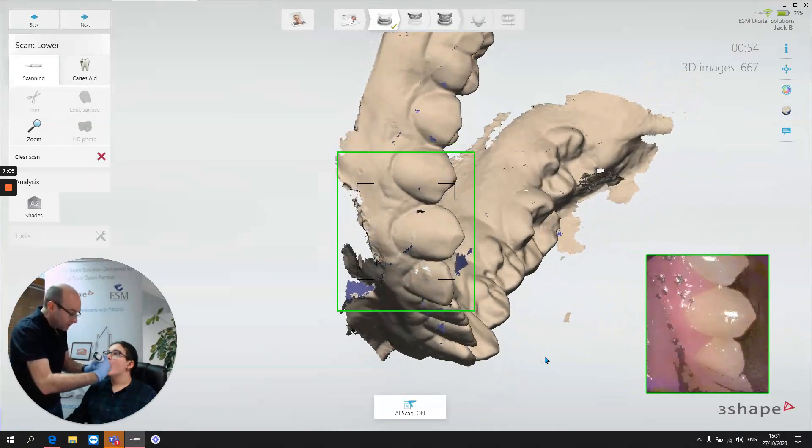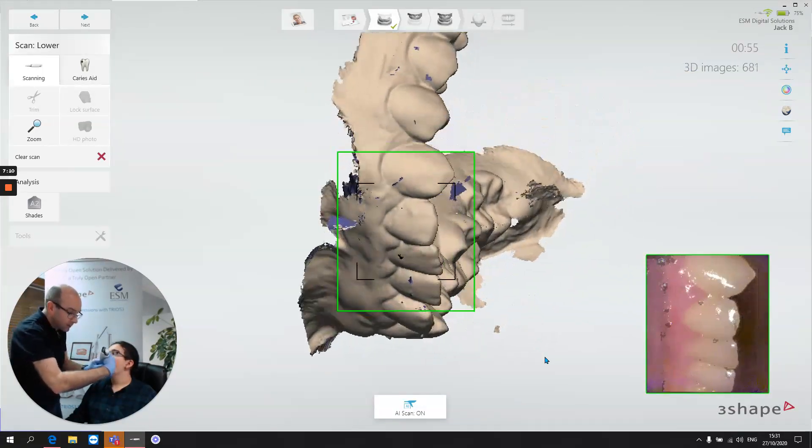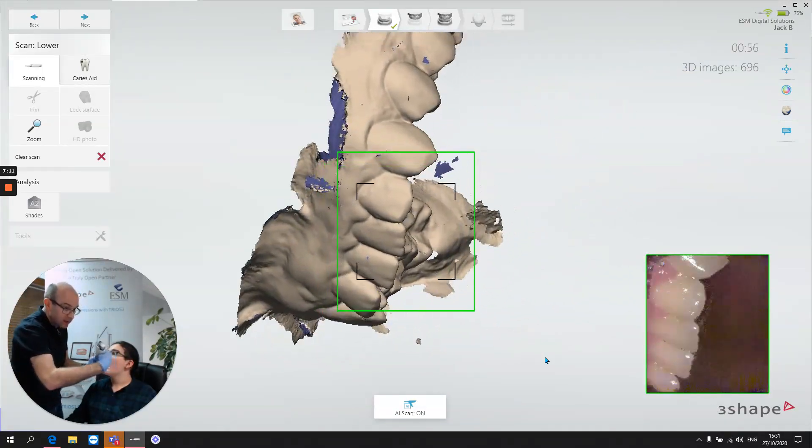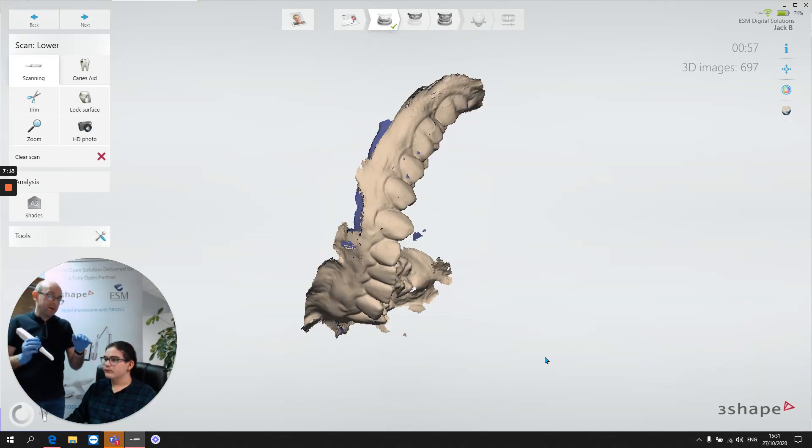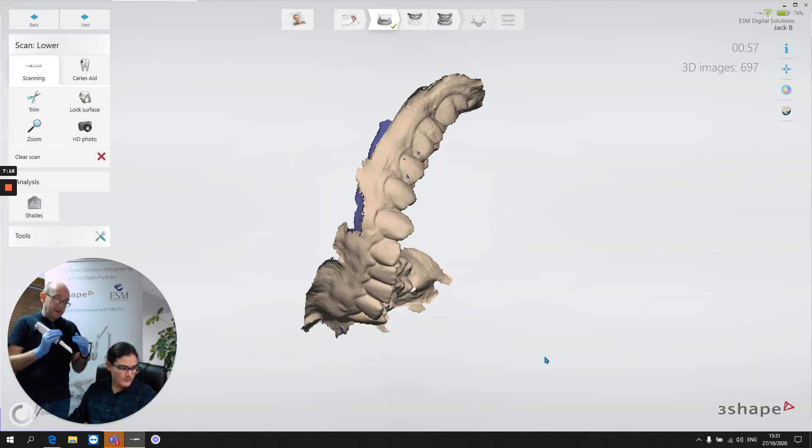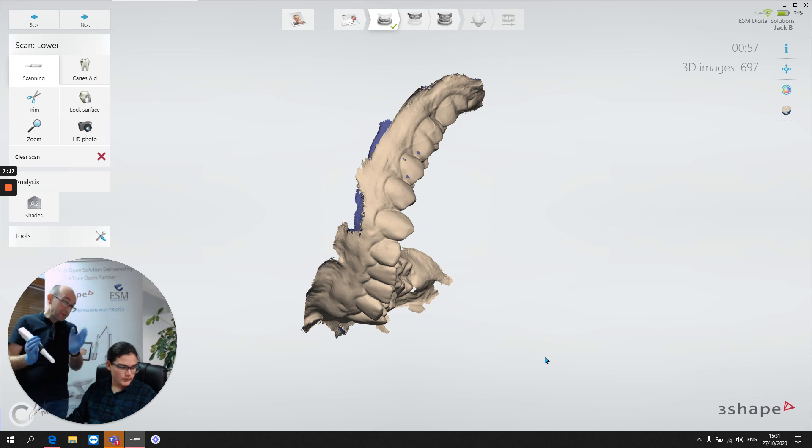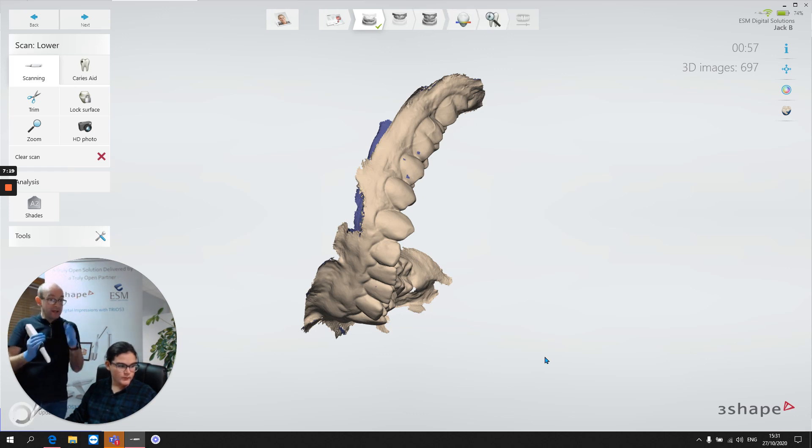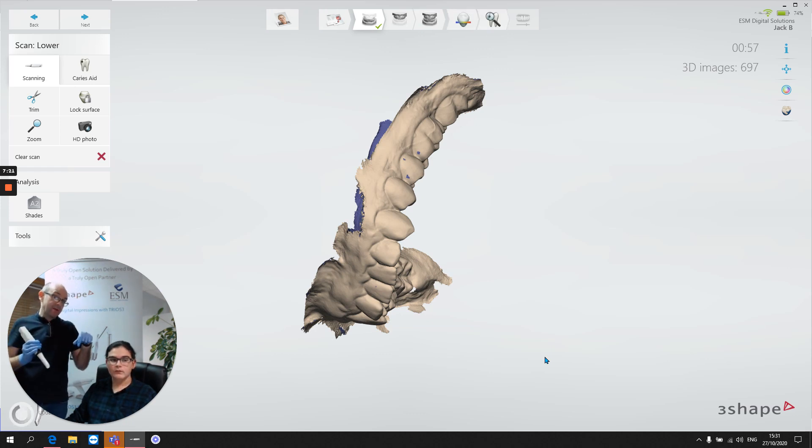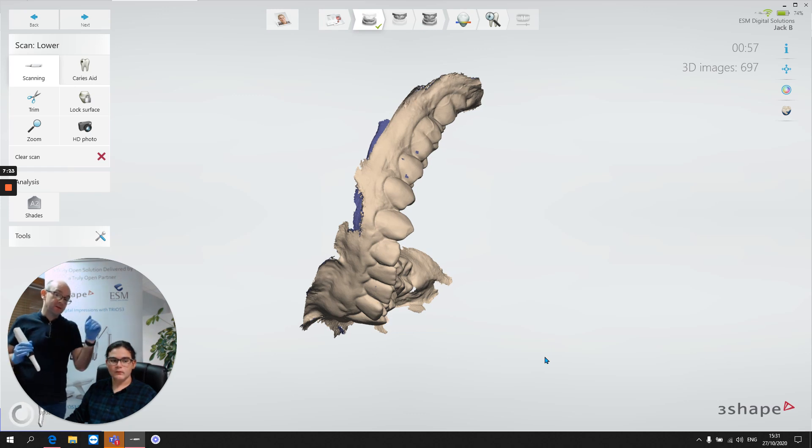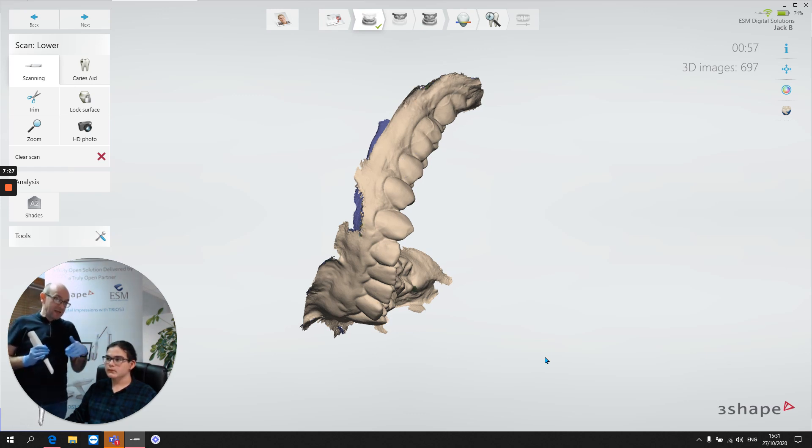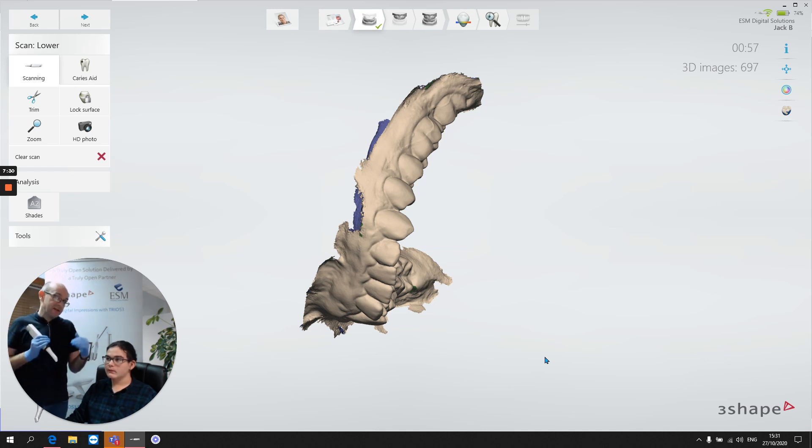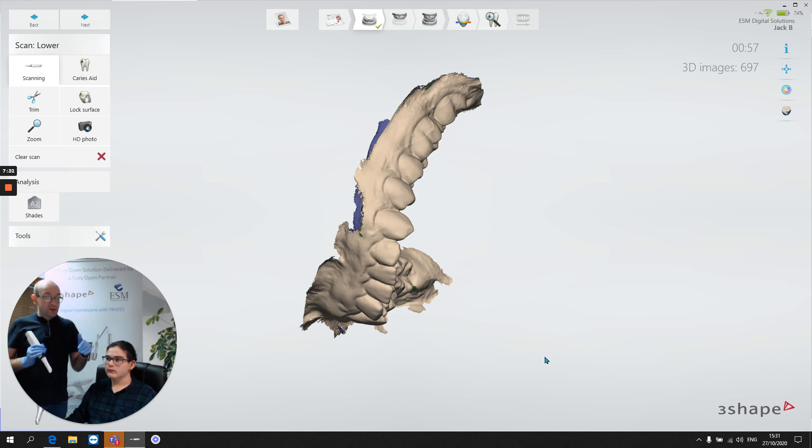And the reason being there, as we saw in that situation where we had a bad occlusal scan, and then we went straight in and we did the buccal scan, everything was kind of okay as we came to the midline and then things started getting worse and worse and worse. So if we do the buccal sweep in two stages, even if there is a slight discrepancy there, slight error, we can get out of jail.